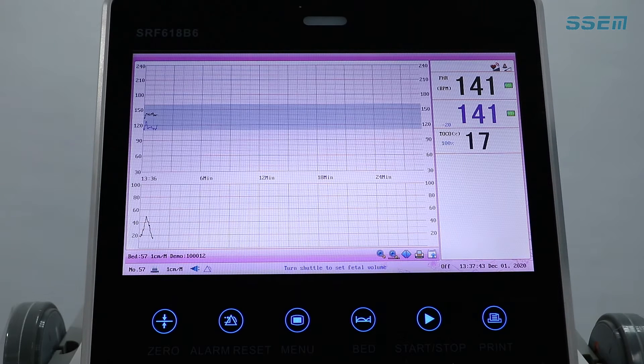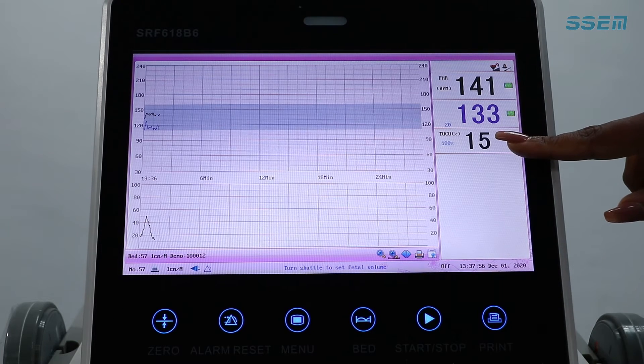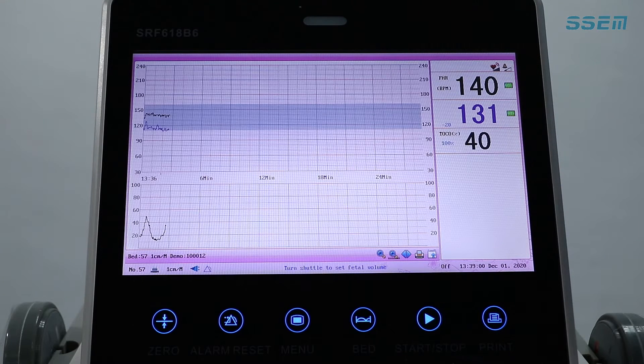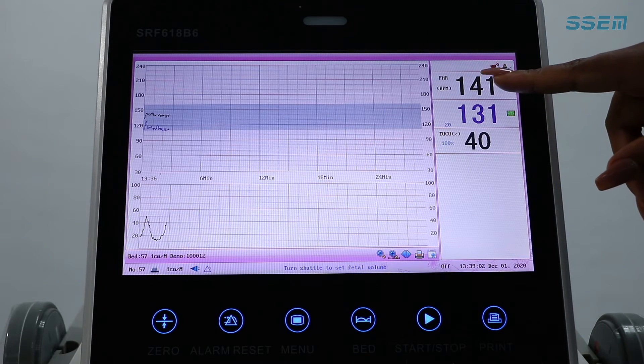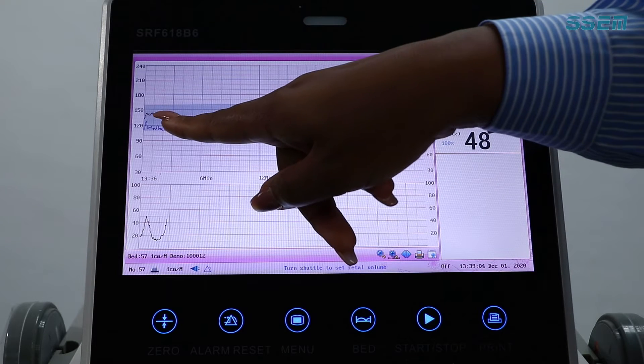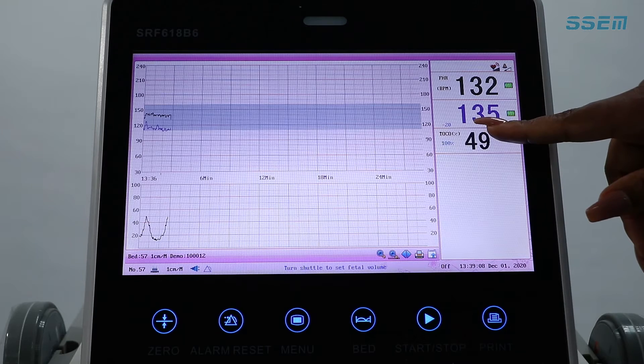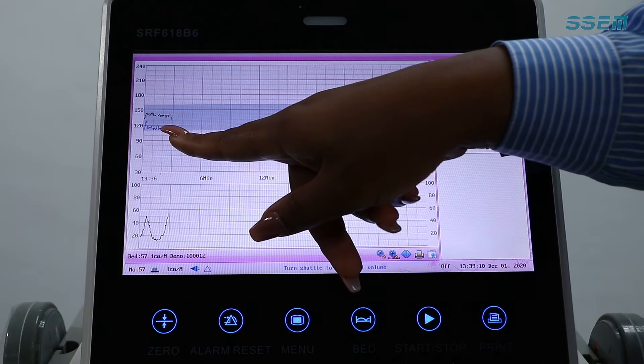Increase the volume to hear the audio of the fetal heart rates FHR once good contact has been achieved. The Toco and the FHR numeric values will display here. FHR 1 is black and it will display on your tracing as black. FHR 2 is purple and it will display as purple.